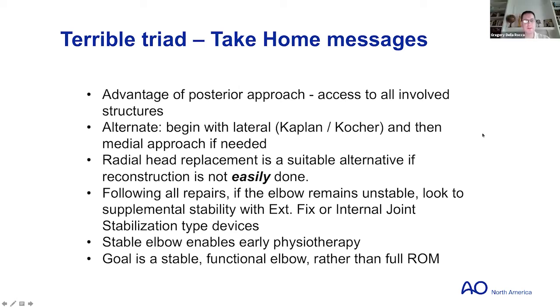I think that was a great summary. I still do use hinged external fixators on occasion. There are numerous different kinds of them. I prefer, if I'm going to use them, to use the ones that are a little bit simpler. Maybe that's because I'm simple-minded. But I don't have a huge amount of need for those. I find that I'm putting an elbow hinge on maybe once or twice a year.